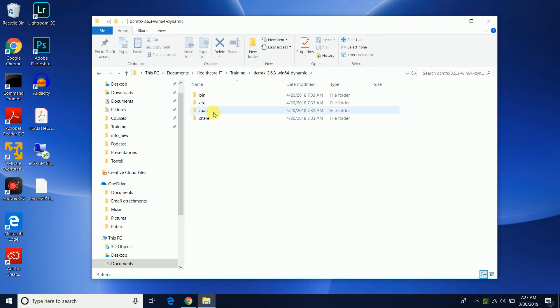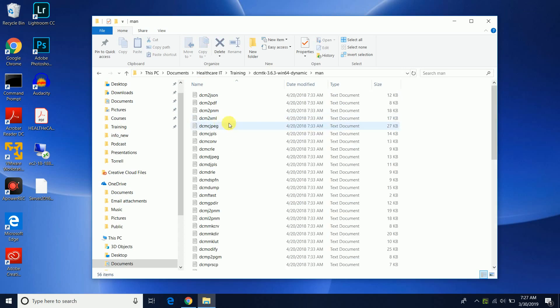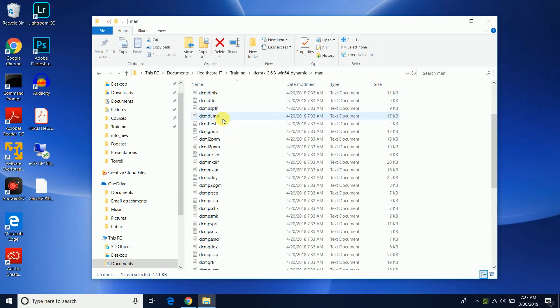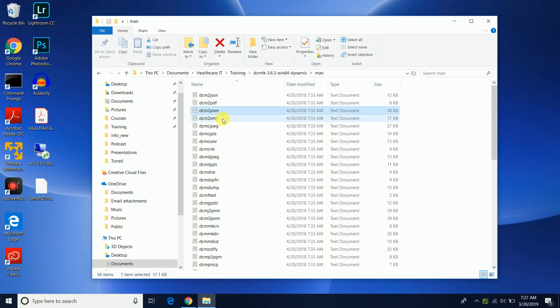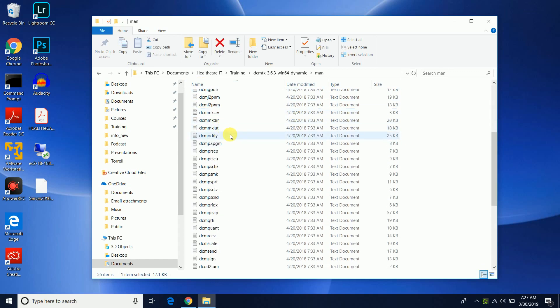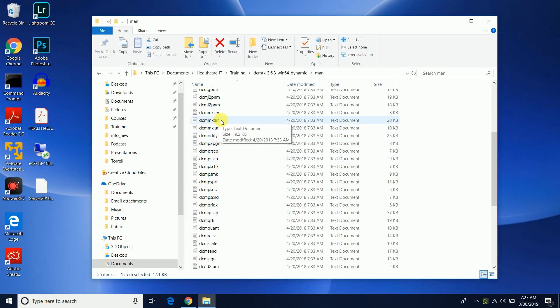So let's go. I already have it installed and just for one minute I'm actually going to the man directory, the manual directory, and you'll see that there's a bunch of these, these are actually manuals for each utility from the DICOM toolkit.